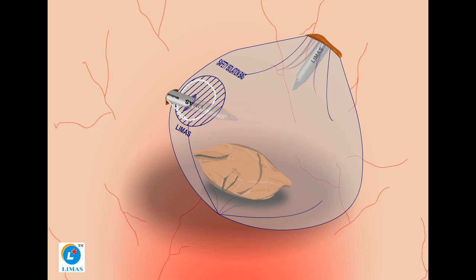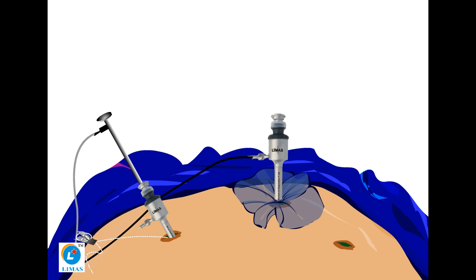Under vision, puncture the Safety Isolation Bag at the non-return valve by sharp trocar by pulling the looped thread. Re-insert the telescope, which was inserted at the mouth opening, through this trocar. Also connect the gas piping to this trocar.